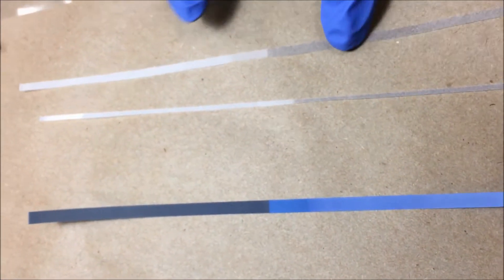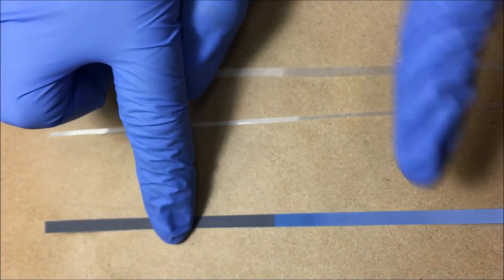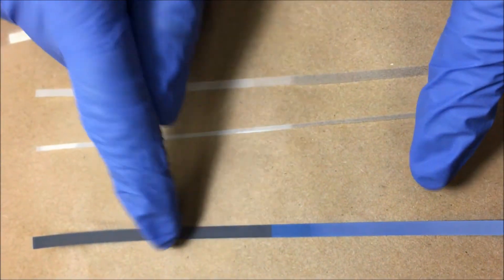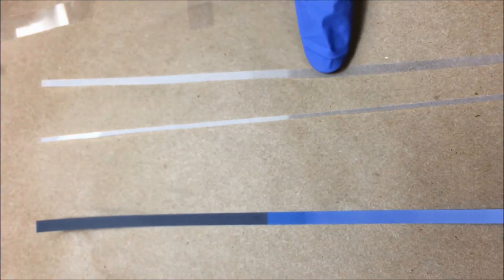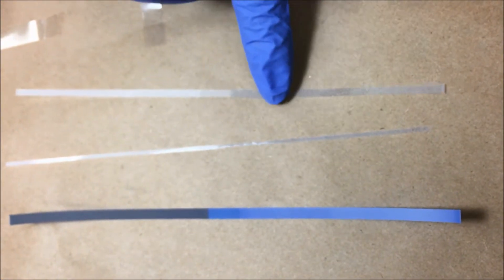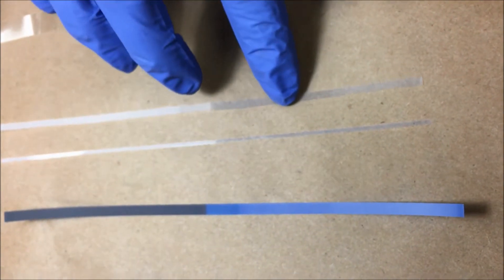So remember brown, white, dark blue, light blue in order of grit from coarsest to finest. And here's a nice little modification. You can buy strips that are thinner. We of course don't do that here. So guess what? You can find the scissors and you can cut your strips thinner.